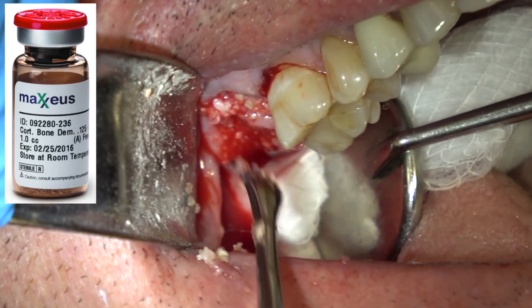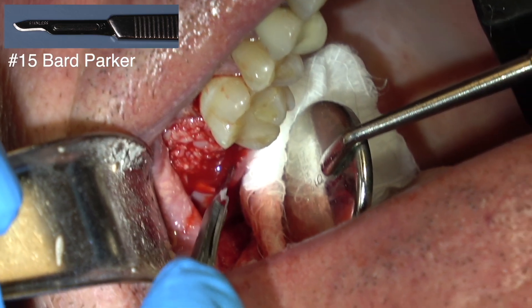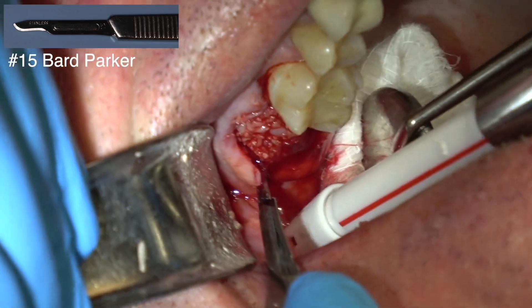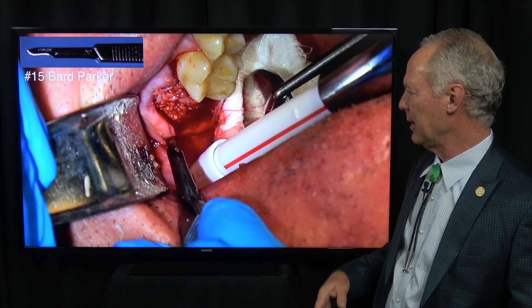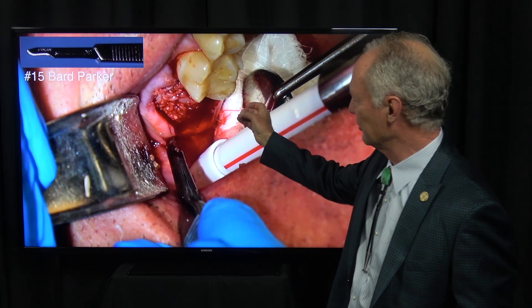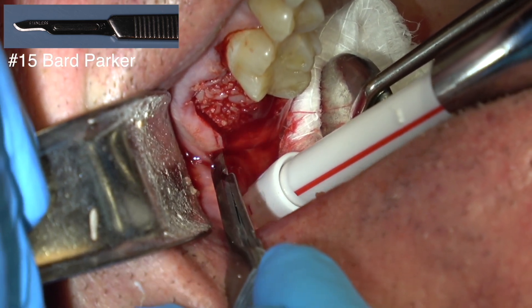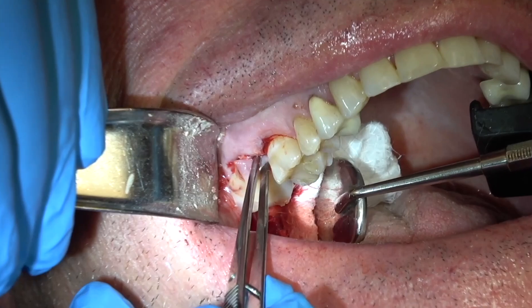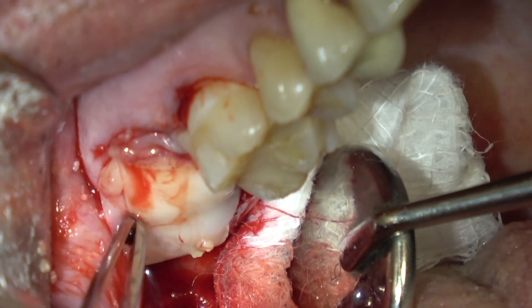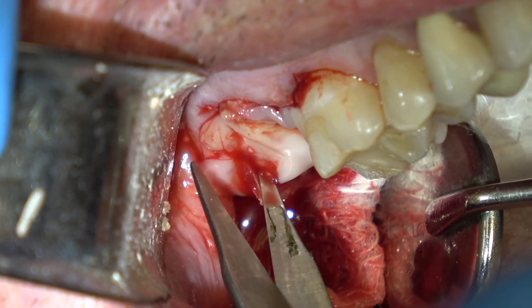Just filling that socket up. I'm making a distal wedge back here so I can approximate — you can see I've made a releasing incision right here so I can approximate the flap. Now it doesn't matter if you have primary closure of the flap; you just want to get it as close as you can. It really doesn't matter if you have primary closure if you place a slab of the platelet-rich fibrin on the occlusal part of the defect. Here's a slab of that platelet-rich fibrin, and I'm just trimming the distal part so it covers the graft.